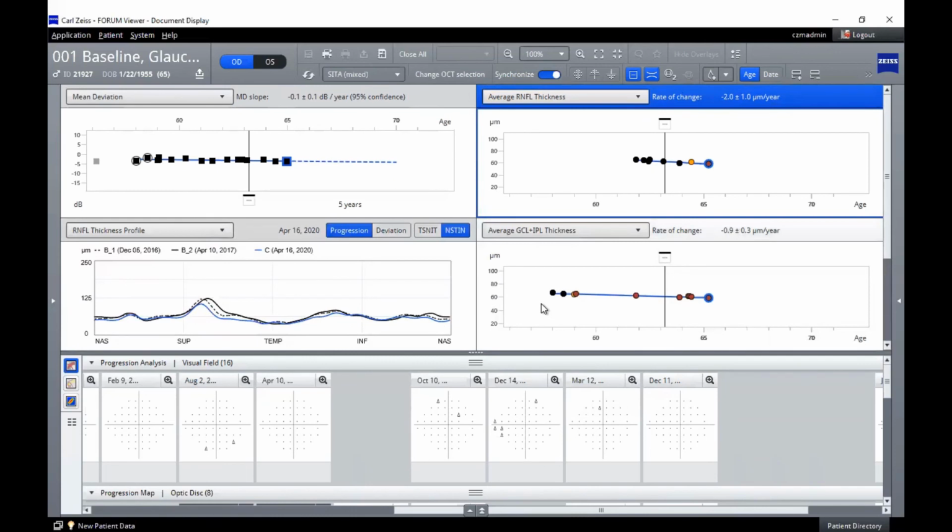Yeah, and so, not to spend too much time in the forum, while it's an extremely powerful tool, I would really want to highlight for our attendees that our management of these conditions is not static anymore. It may not have ever been static, but it felt static at times when you rolled out the scroll of the visual fields that went down the hallway, right? Or when you tried to figure out, as you sorted through your OCT reports, which report do I want to pay attention to and where's that date? To have it all at our fingertips here, to be able to touch it, manipulate it, understand and input clinical events, and have an idea that, wow, this really worked.